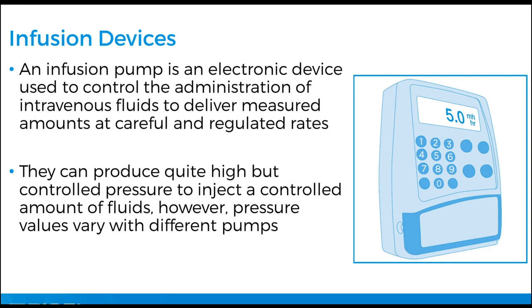An infusion pump is typically electronic and used to control the administration of these intravenous fluids to deliver a measured amount at carefully regulated rates. They can provide quite high but controlled pressure to inject a controlled amount of fluids. However, pressure values vary with different pumps.